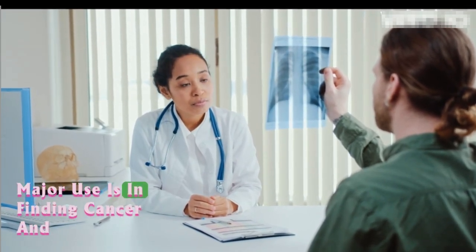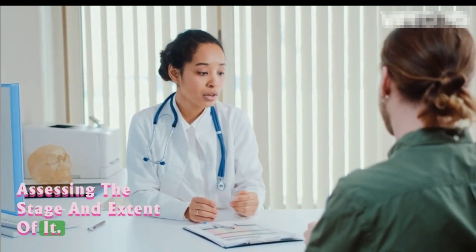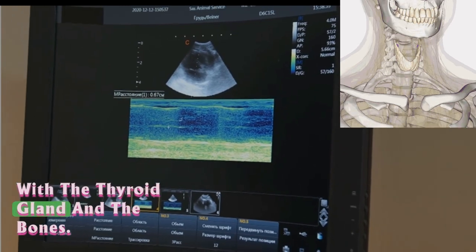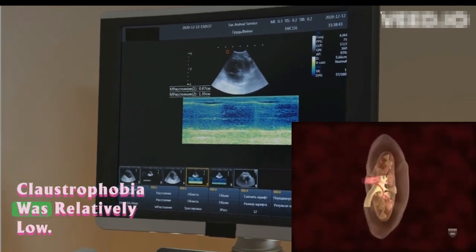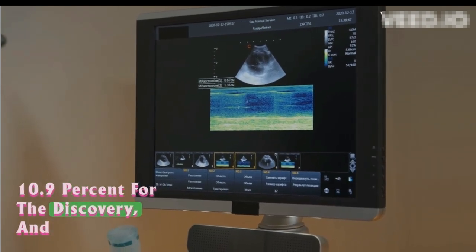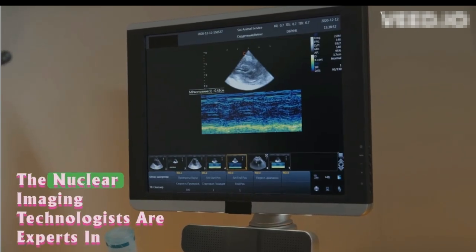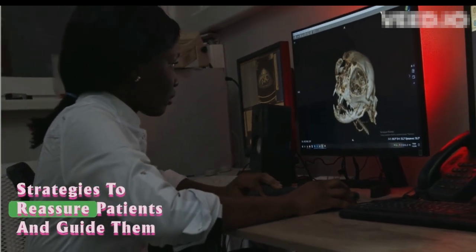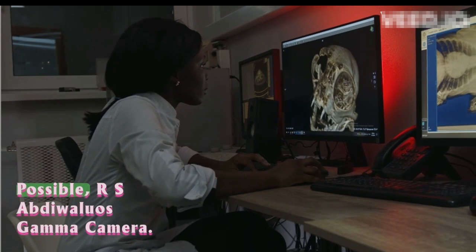One major use is in finding cancer and assessing the stage and extent of it. It is also used to assess issues with the thyroid gland and the bones. The subjective experience of claustrophobia was relatively low: 10.9% for the Discovery and 11.6% for the Veritan CT. The nuclear imaging technologists are experts in strategies to reassure patients and guide them comfortably through the scan as much as possible.